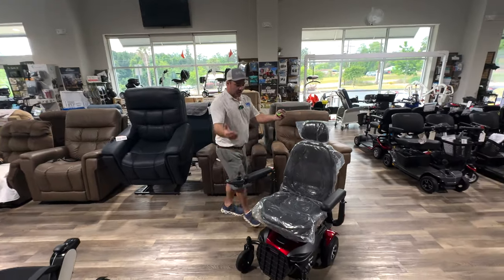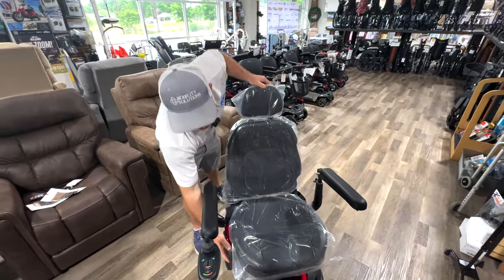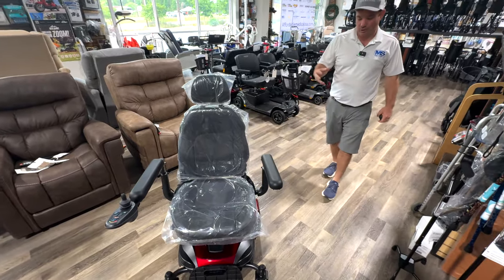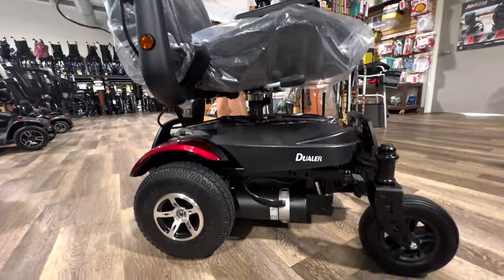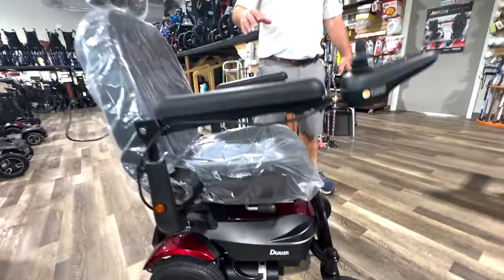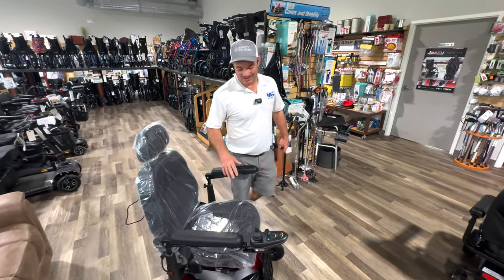The arms are adjustable in height and width and they flip back. You do have a swivel seat that goes all the way around since you can change it. It has decent ground clearance and really strong motors, so it can perform in your yard. You can also flip it to front wheel drive for tight turning inside your house, and switch back to back wheel drive when you go outside.